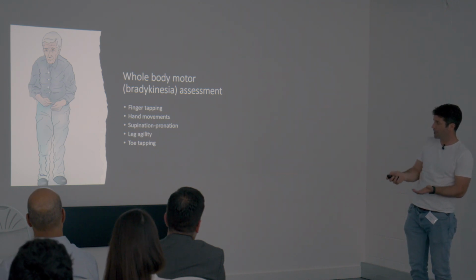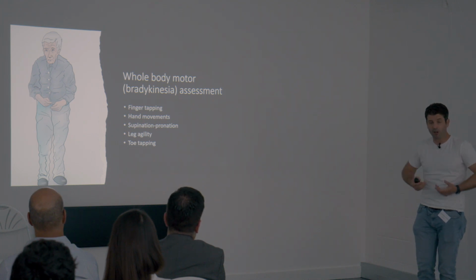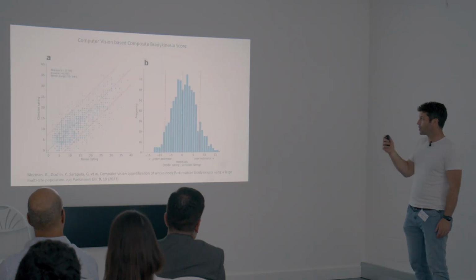One of the things we subsequently went and did is said, well, how about if we put a bunch of these scores together? Can we characterize the whole body function of a patient in a sensible way? And it turns out we can.